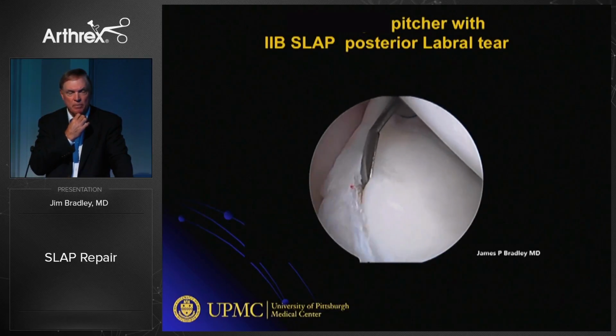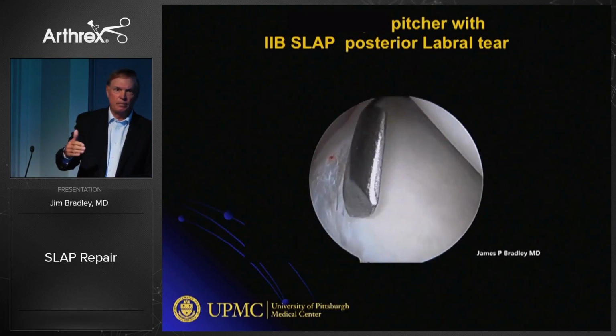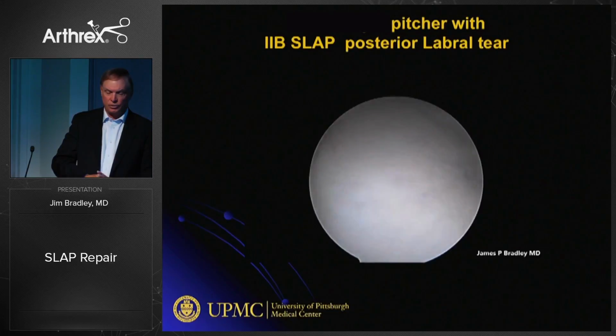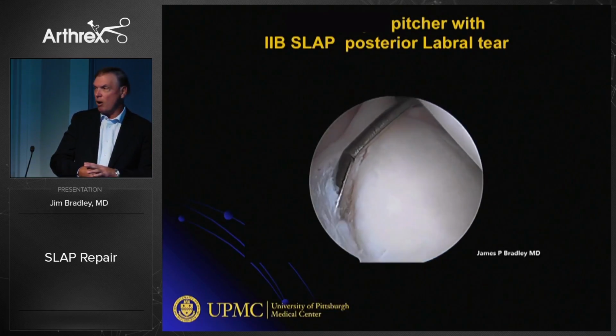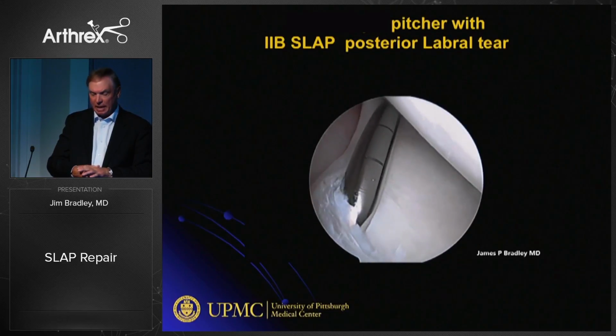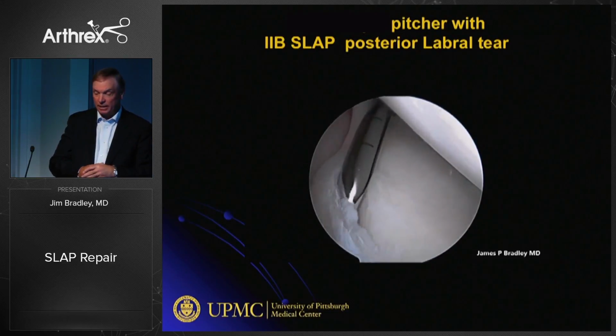The mistake people make is they spend too much time thinking, oh, there's the lesion, let's fix it. No. You've got to prepare the rim to accept the sutures, and so you don't just spot weld it, you heal the whole thing down. It's really important, and I harp on it with my fellows all the time. I'm not a very patient person, but now I'm patient for this. You've got to be patient for certain parts, but this I'm patient with.